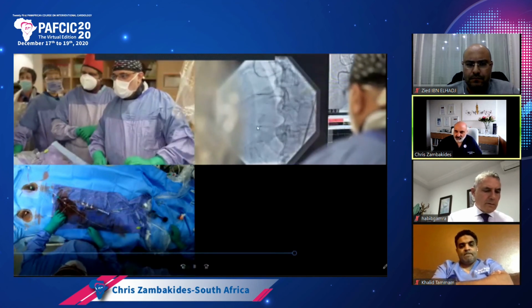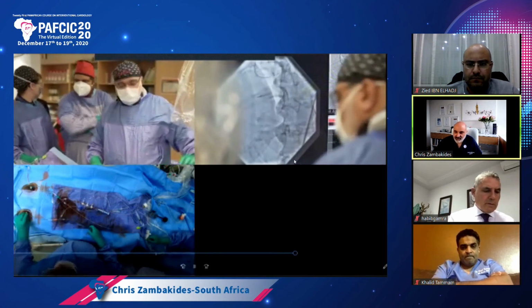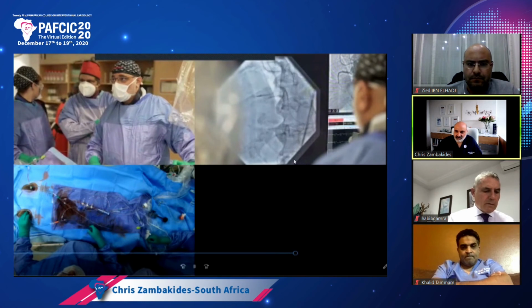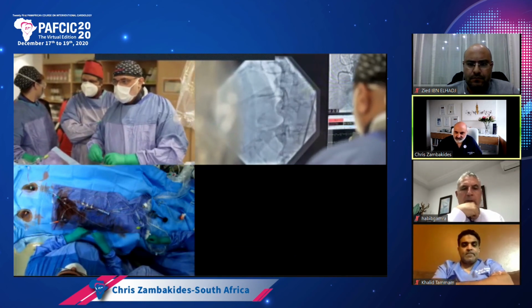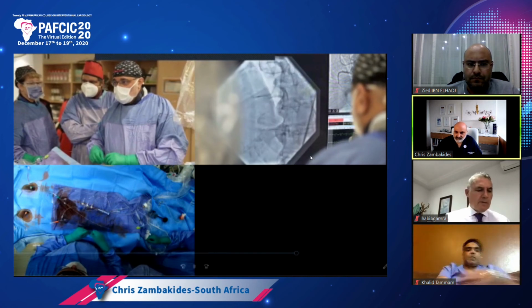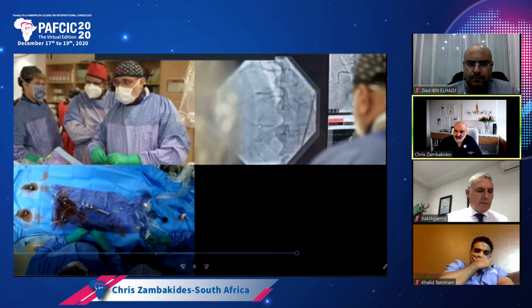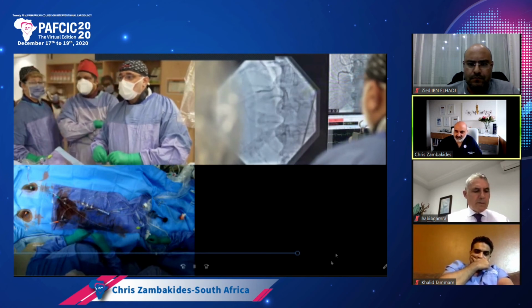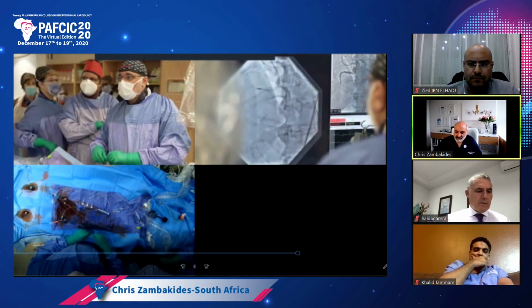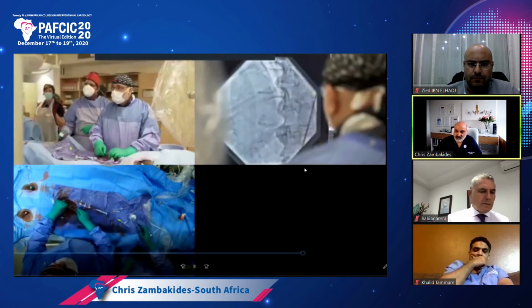So your guide extension is over there. There's your microcatheter, and you can see that your retrograde wire is now getting into the guide extension and into your antegrade catheter. Can we get the RG3? Yeah, we should be able to. So for resistance, what we also did was trap.